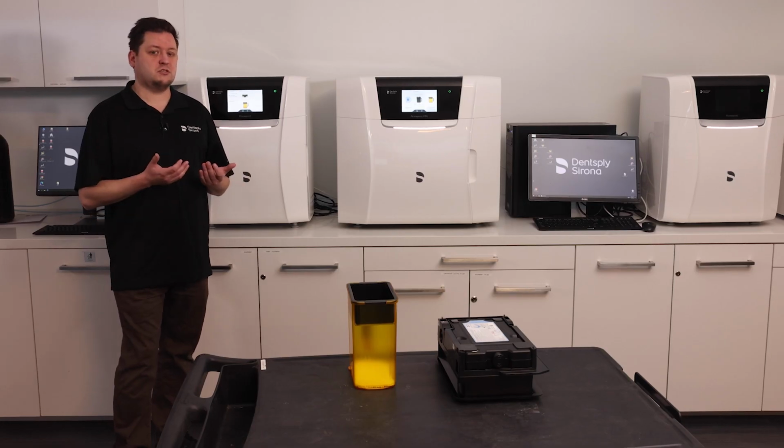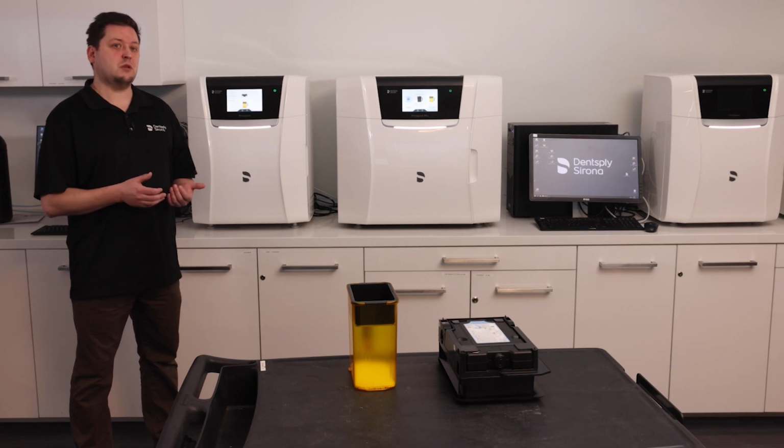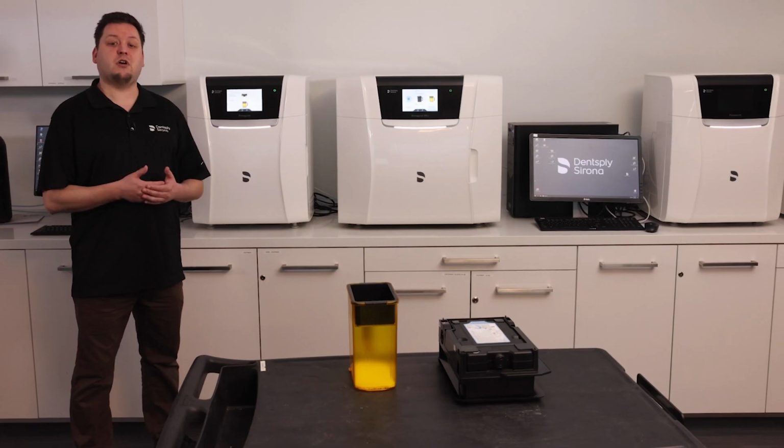Before a print job starts, the printer will always dispense some of the resin that's needed, and it will heat it up to the proper temperature. This will take between 5 to 15 minutes depending on how much resin is needed. So what you can do with preheat is start that process ahead of time before you begin printing. Let's show you how to do that.